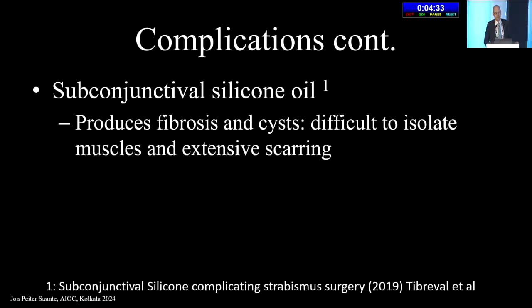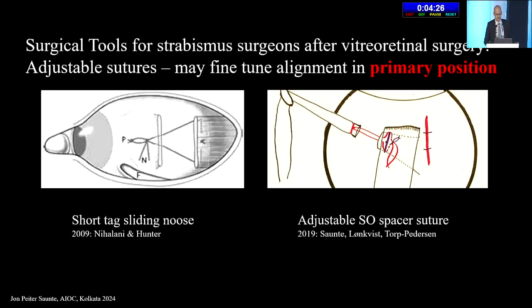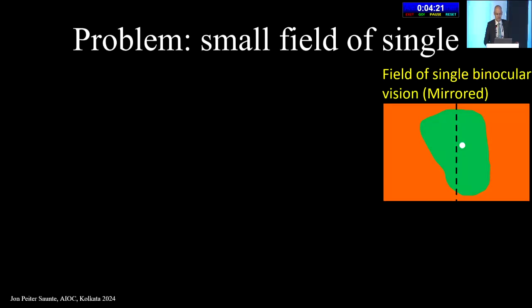Silicone oil is another unfriend during these surgeries. They can produce fibrosis and cysts. And adjustable sutures may help you reach the goal and do what you want to do.